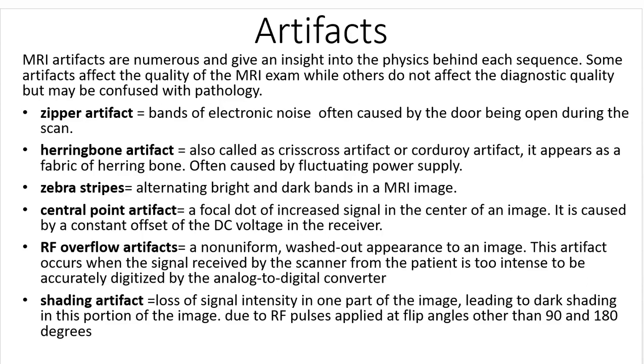So, I know I put your MRI physics to test with that. I wish I had images of each of these artifacts that I could show you, but usually these images get deleted. They're not sent to PACS. When you see those artifacts, they're usually not kept because they are low quality and they're not good for diagnosis. So, if we see one, I'll be sure to point it out.